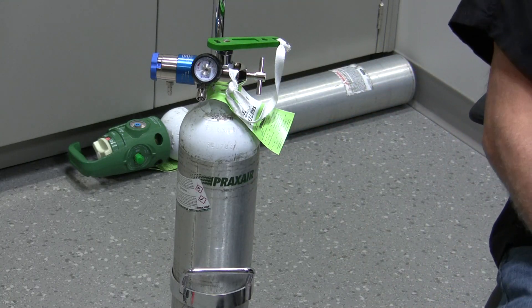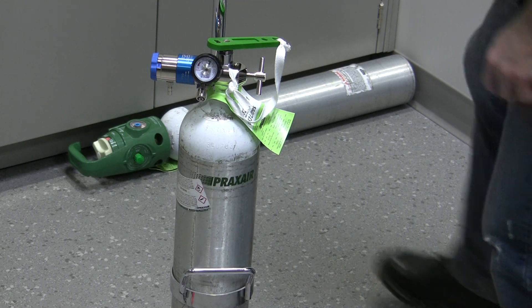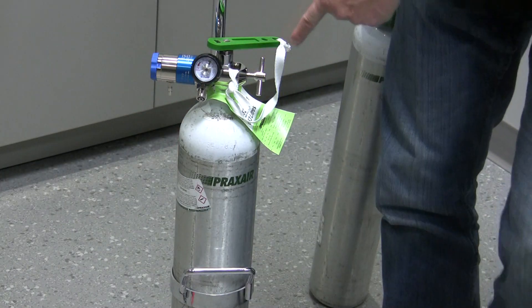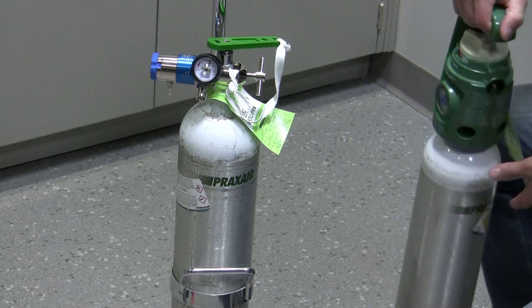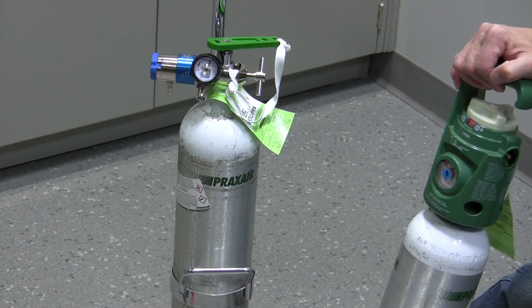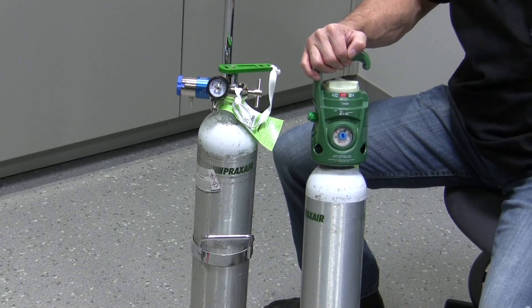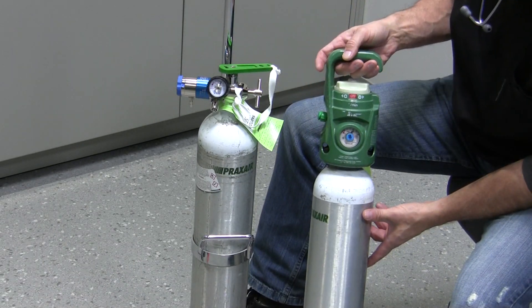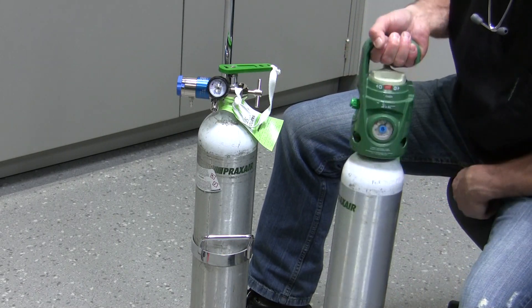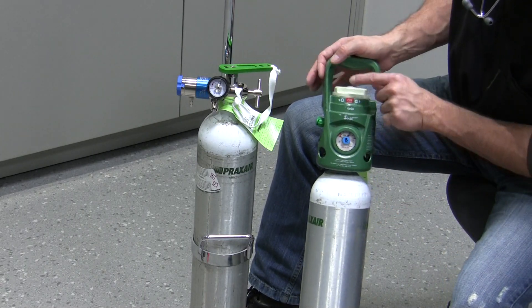Now what you might also see out there is something called the grab-and-go. The grab-and-go oxygen cylinder is essentially a compressed gas cylinder just like this one, with a slight twist. Instead of having to add the regulator onto the cylinder separately, this one already has the regulator incorporated into the design of the cylinder. It's got a handle here — this is the grab part — and you can grab it by the handle and you're good to go.